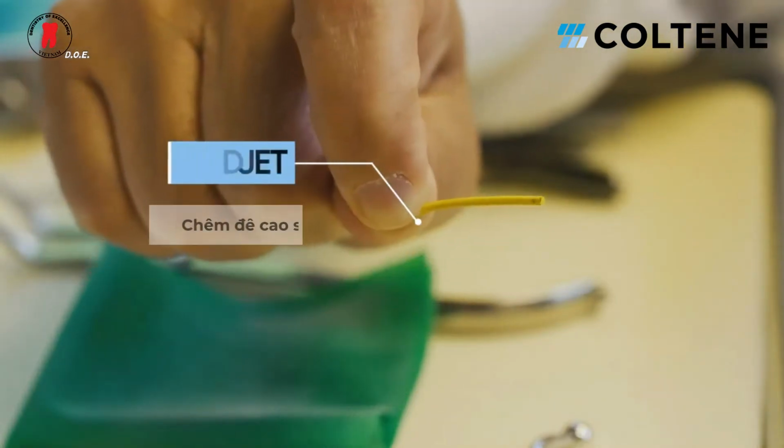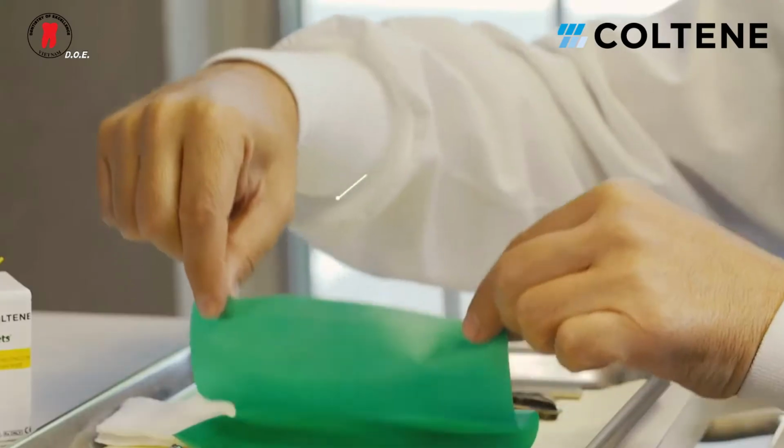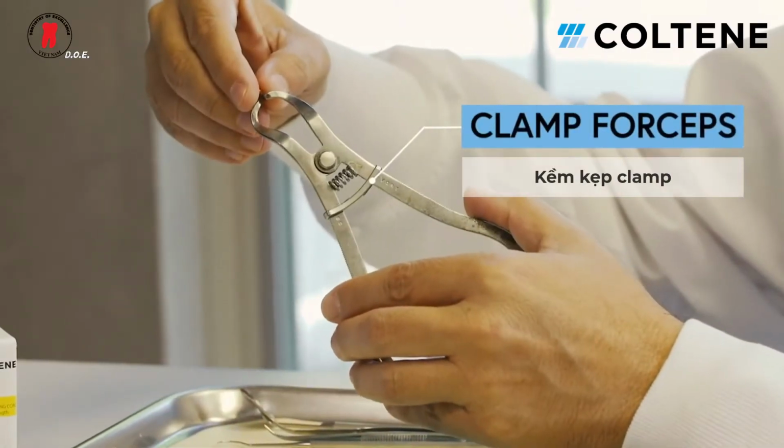I have a wedget. We have our rubber dam stainless steel frame. We have selected a 6x6 rubber dam, medium thickness, and we have our clamp forceps.